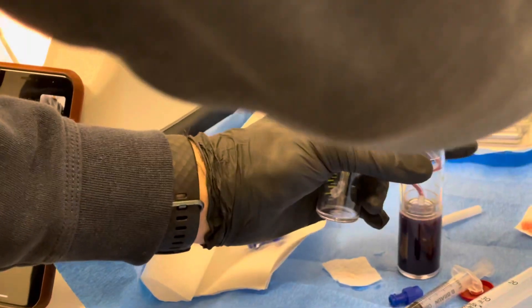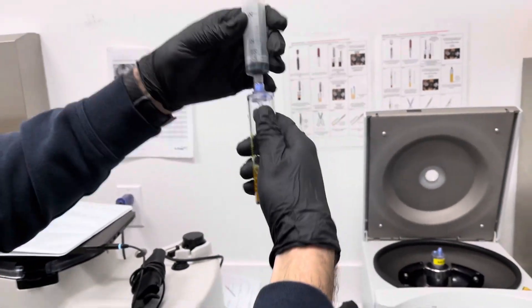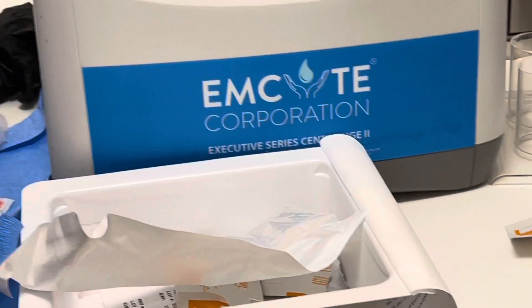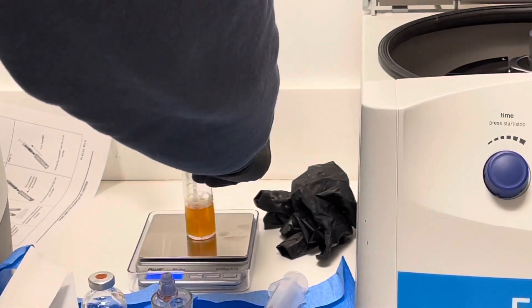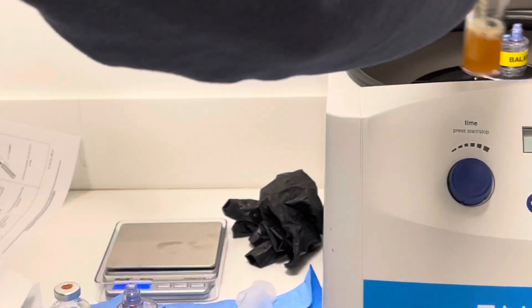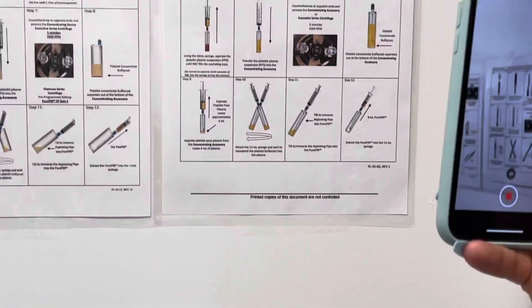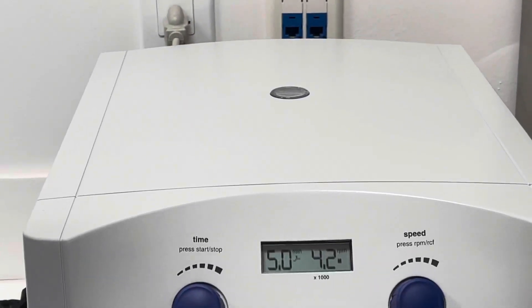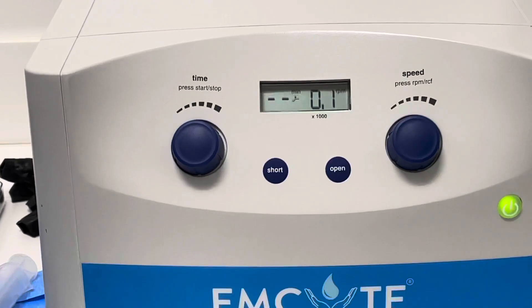This goes into tube B. We can even eyeball the second one and they look about right, so I set them up pretty well. 39.1 and 39.4 — perfect. One in either side. I always recommend checking this. The second spin is five minutes. Press the start button, and then we've got about seven minutes.